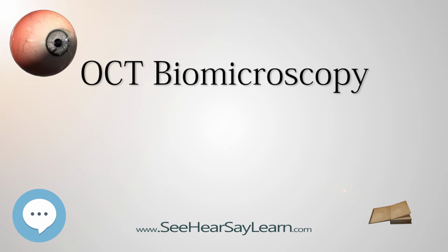Furthermore, commercial SD-OCT devices also produce mirror image artifacts around the zero delay position. Although this is infrequently distracting in posterior segment imaging, it can be quite confusing when imaging near the iris plane. Swept source OCT, SS-OCT.